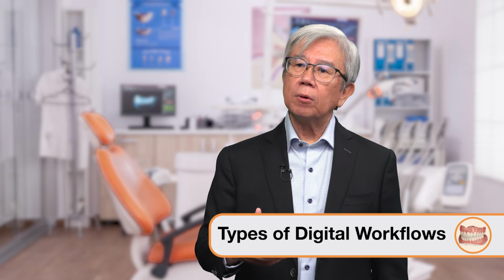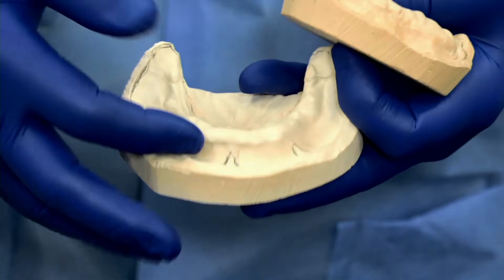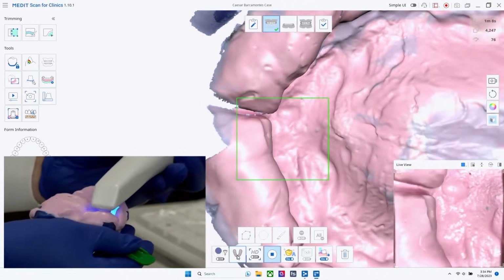Usually there are many. Compared to that, the digital workflow is slightly different, but there are several different pathways where a dentist can get in this workflow. The first one I can think of is someone who's very comfortable taking analog impressions. Whatever impression material technique that you may use, you have the final impression, let's say. And you can pour that up and scan that with an intraoral digital scanner that you have in the office. Now that becomes digitized and you're in the digital workflow. Or you can scan the impression itself.